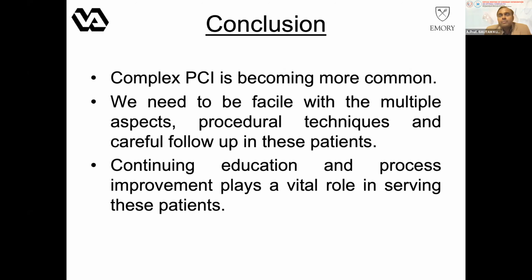So Duane, it's interesting because in DEFINE PCI, it was 1/3, 1/3, 1/3 in the patients who had abnormal iFR post-PCI. 1/3 of them were distal to the stent, 1/3 were within the stent, and 1/3 were proximal to the stent. Now, within the stent, you can say that may be amenable to more extensive lesion prep that could have helped. For distal and proximal to the stent, you're absolutely right. There is probably more extensive diffuse disease in the vessel. And those of us who use more IVUS are able to identify this. You see this all the time.